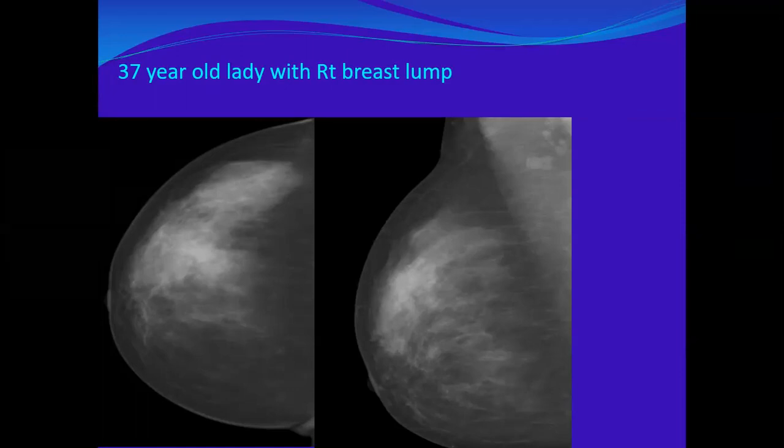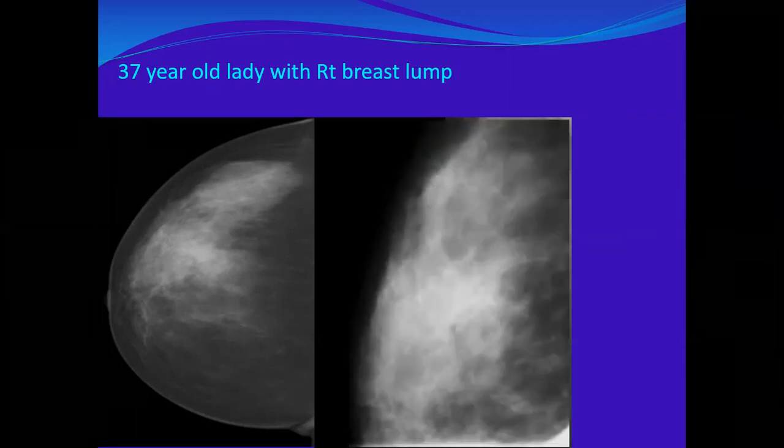Okay. So next step, I want to do spot compression for this lesion, for this area. Okay.